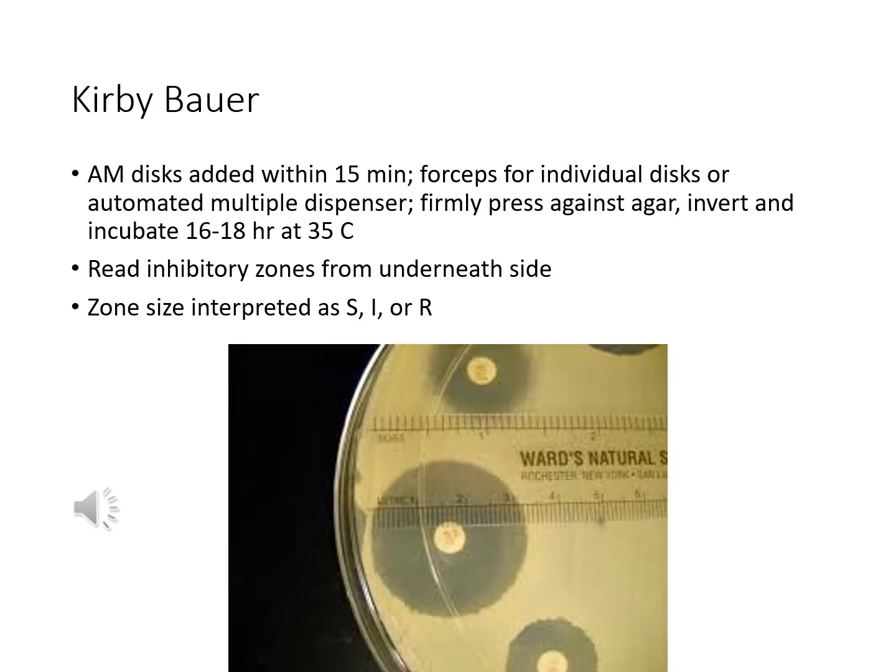Within 15 minutes of inoculating the plate, you need to drop your disc. There are devices that may hold up to 10 to 12 different antimicrobial discs. You press the plunger of that into the agar, and then all discs are dispensed over the top of your Mueller-Hinton plate. You'll invert your plate and incubate for at least 16 to 18 hours.